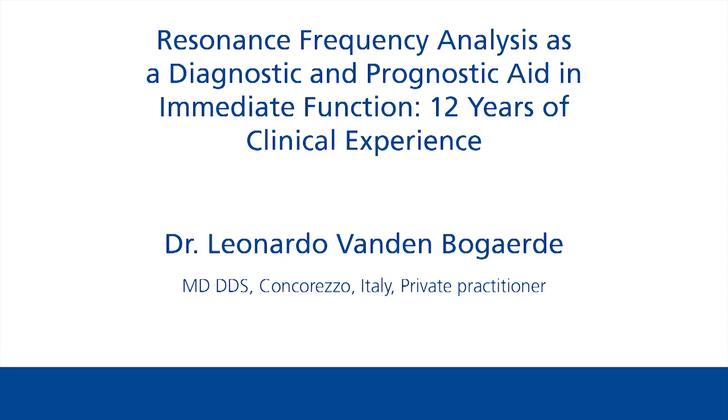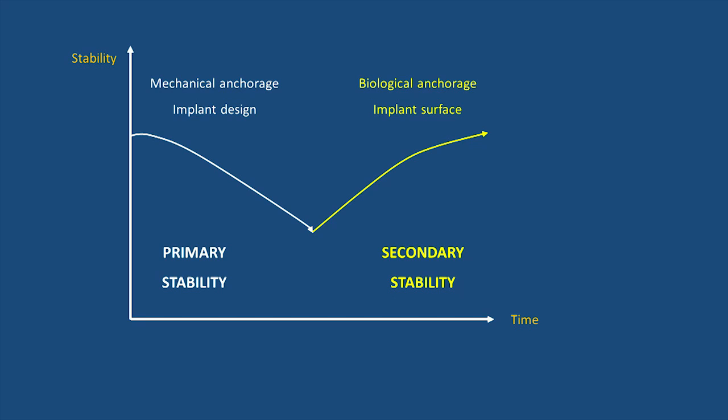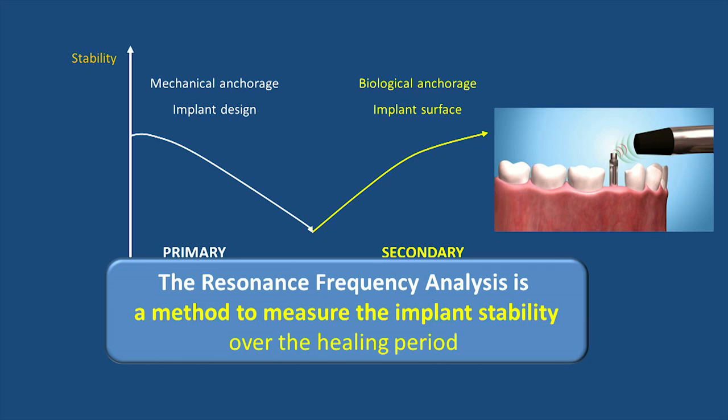I'd like to share with you my experience with resonance frequency analysis as a diagnostic and prognostic support in immediate function. You know that when you place an implant, you have a mechanical anchorage in bone, the primary stability, and this primary stability very often tends to decrease, after which the anchorage in bone is ensured by secondary stability. And resonance frequency analysis is a method to measure the implant stability over the healing period.